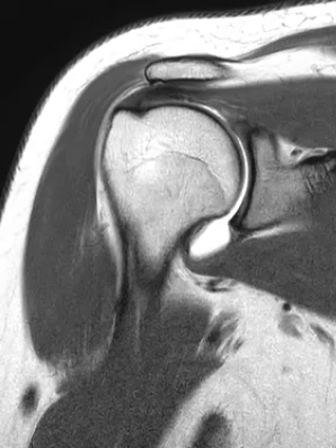The biceps tendon is one of the things we look for in the shoulder joint. It starts up in the shoulder and goes all the way down below the elbow, attaching in the forearm — the very proximal forearm on the radius. It is a very long muscle and tendon.